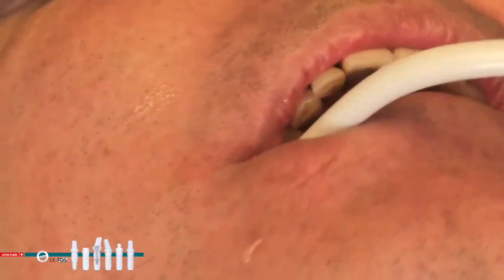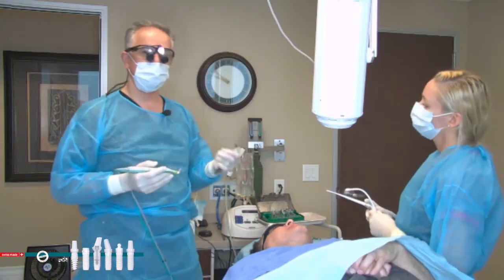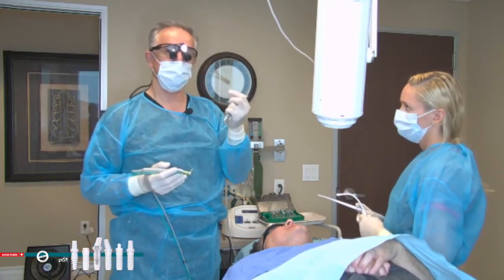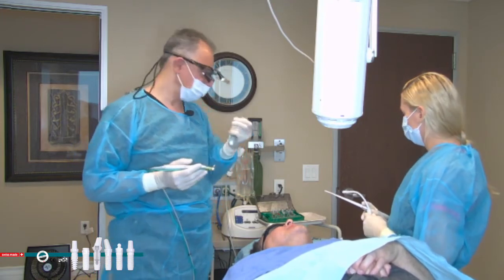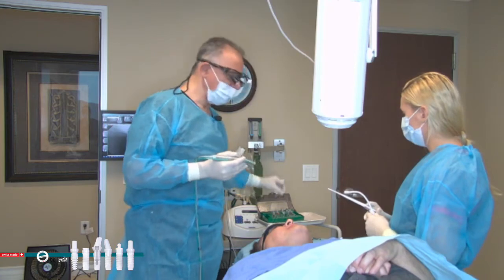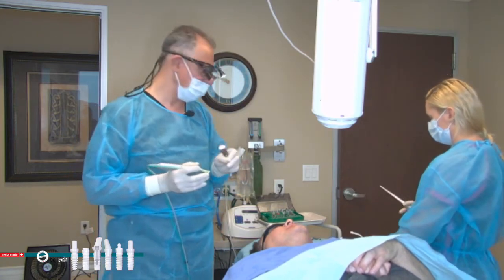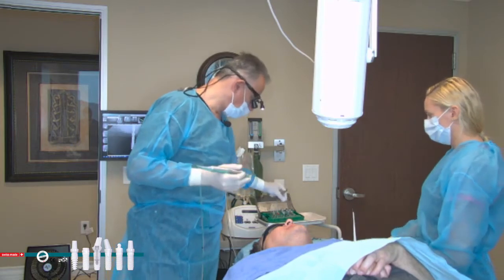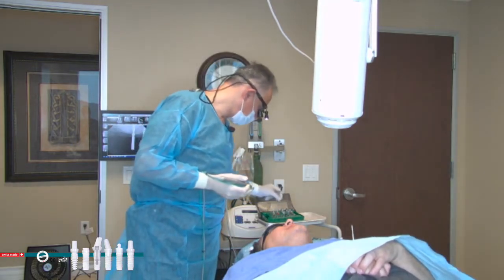Yes. And because this was a soft bone, it's a sinus grafted bone, we don't have to use a tap. Normally in the lower jaw, I use a tap. More dense bone, you use a tap. For the upper jaw, upper posterior, typically you don't have to use a tap, especially when you feel it's soft. So let's get a 4x10 Z5M.